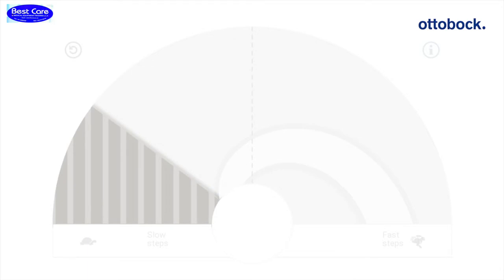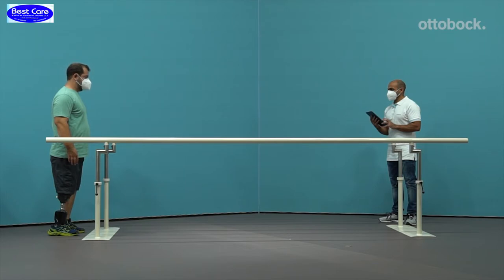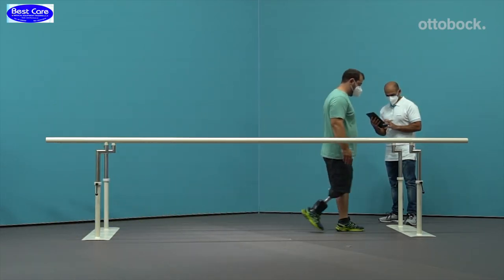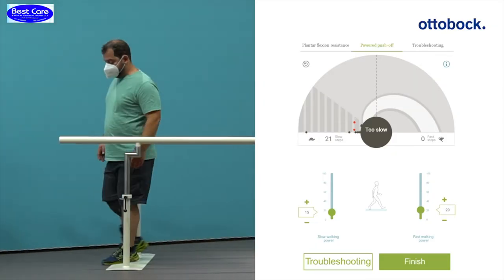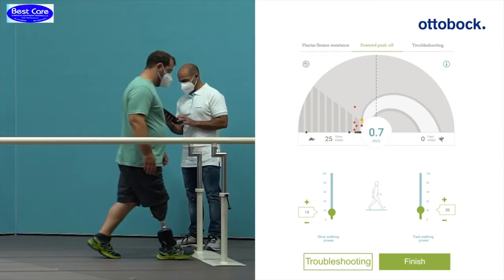If steps are falling into the dark gray hatched area, the user is walking too slow. In this example, the user walks too slow to generate a sufficient powered push-off. The steps plot in the dark gray hatched area. Encourage the user to walk slightly faster so that you can properly assess the current power setting.